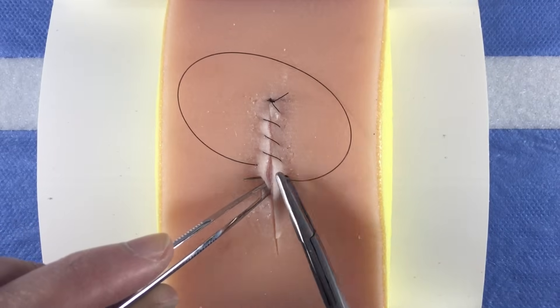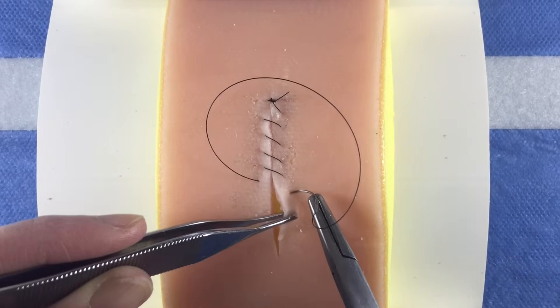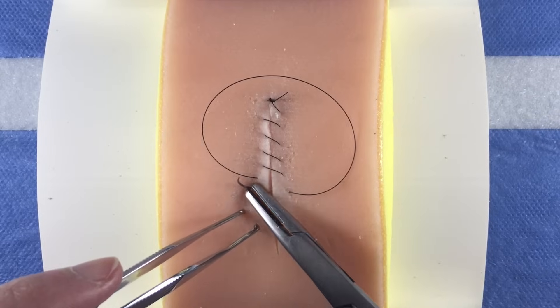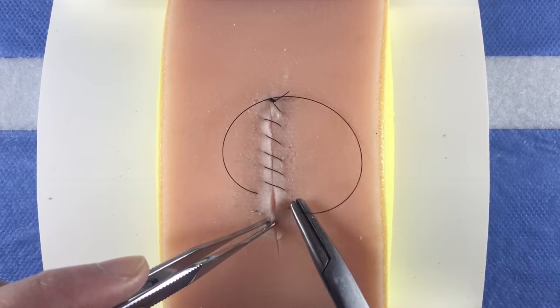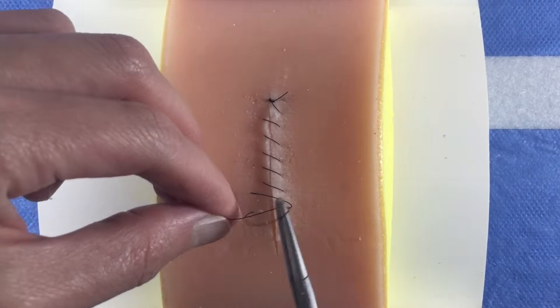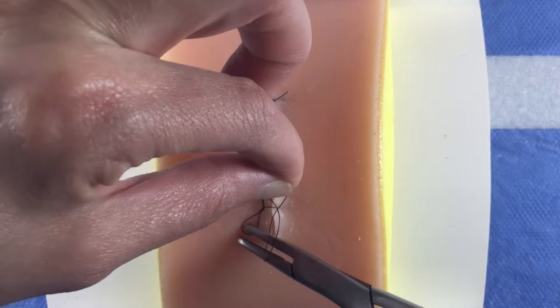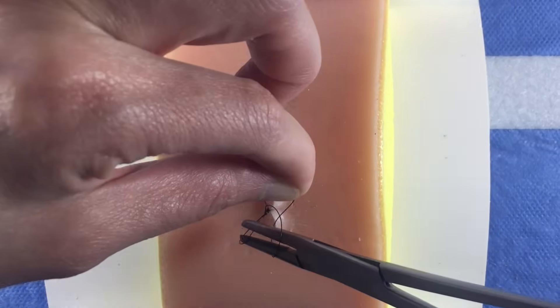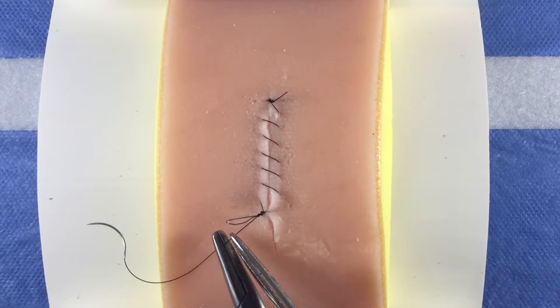Continue to close the wound in this fashion. When you arrive at the opposite end of the wound, tie the suture strands together using either a hand or instrument tie. Then, cut your suture.